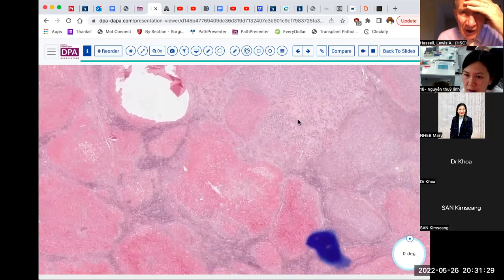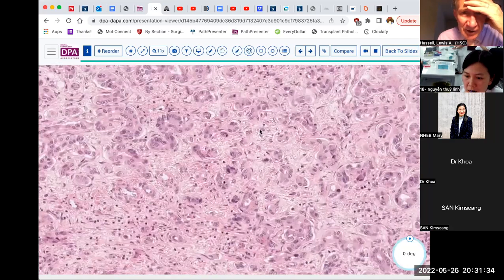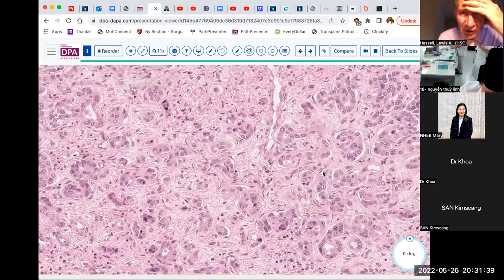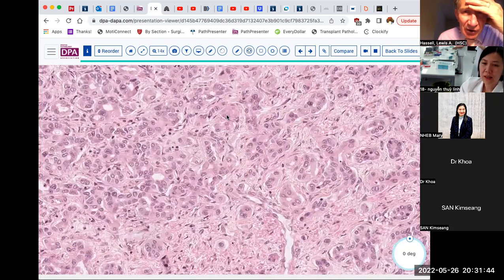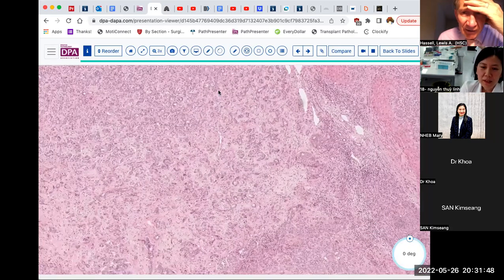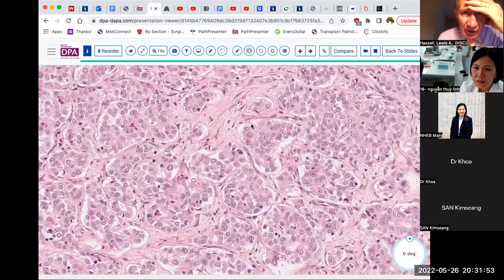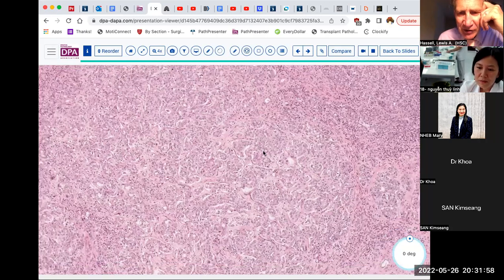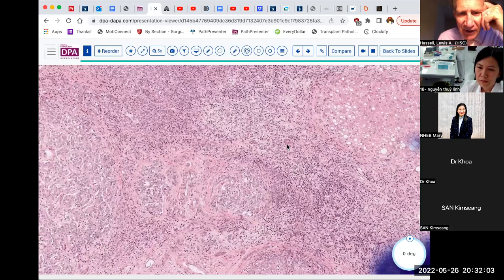So we do have a cirrhotic background, but looking at this tumor, this does not look like hepatocellular carcinoma. This is small rounded glands, small glands, single cells. This looks like a cholangiocarcinoma or possibly a metastatic carcinoma from another site. You'll have to take my word for it that this was evaluated and found to be cholangiocarcinoma. And so hopefully you'll believe that and can see some of the pattern.